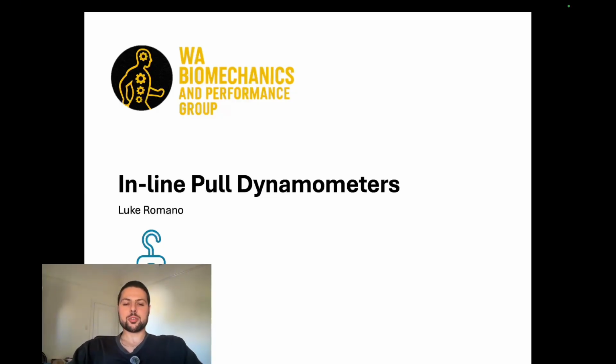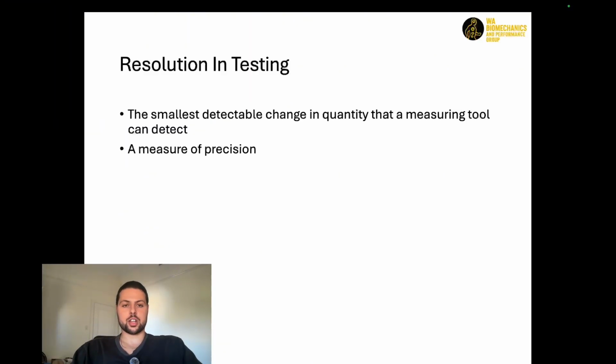Dynamometry is just a large part of the way I practice in terms of my model of care. And I feel it might help you guys with increasing your confidence in how to assess and treat an individual, and help give you confidence in when to progress your patient's care in their rehab journey. It can also be really helpful in guiding clinical decision making and giving treatment ideas, and giving you an idea if your adaptation-led rehab is having an effect. So let's crack straight into it.